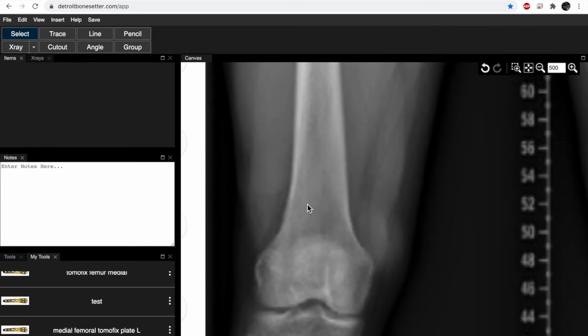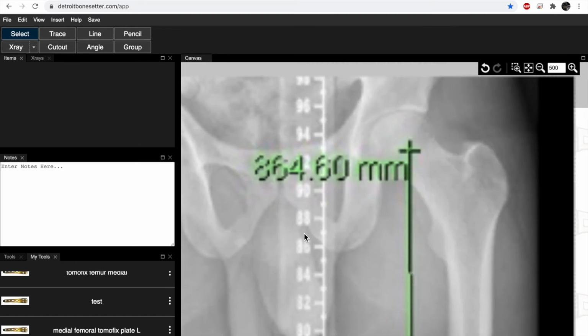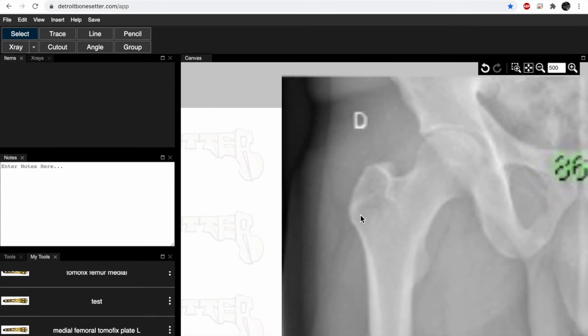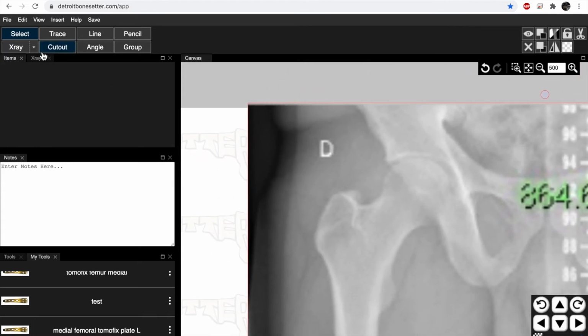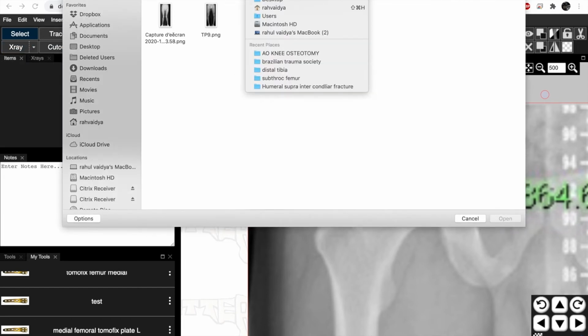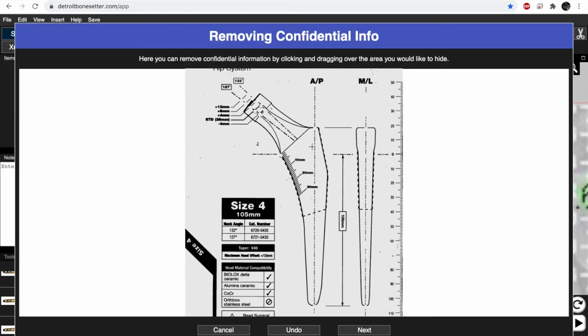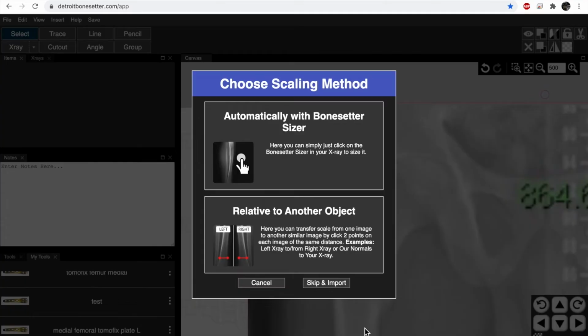What if I want to make a template for like a hip replacement or a knee replacement? So what I'm going to do now is I'm going to again go to X-ray, and what I did here is I photocopied a transparent template, one that a company gave us, and I put it in here. And this is the template. You can see the size and everything. So what I'm going to do is I'm going to size it.